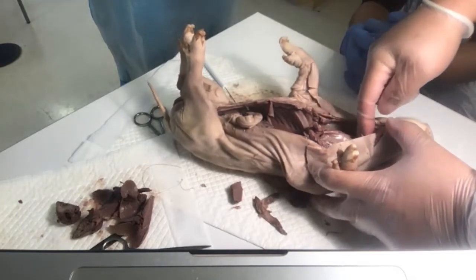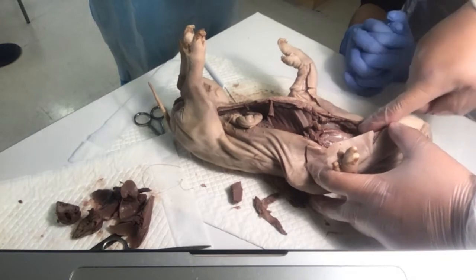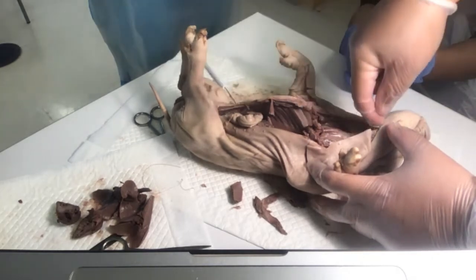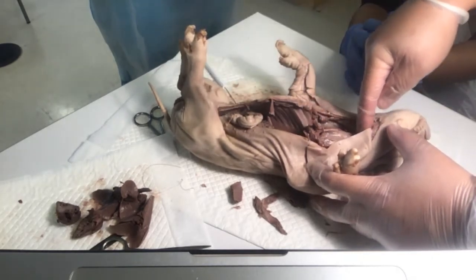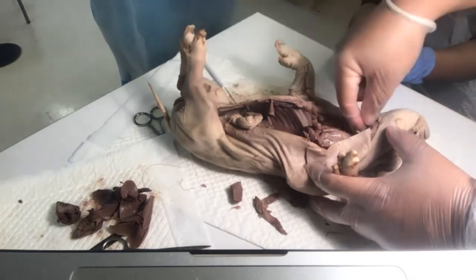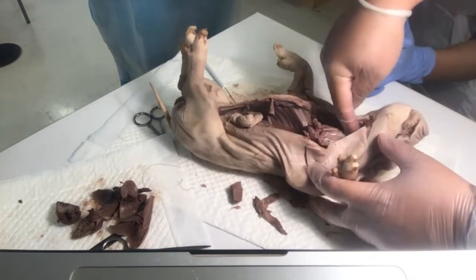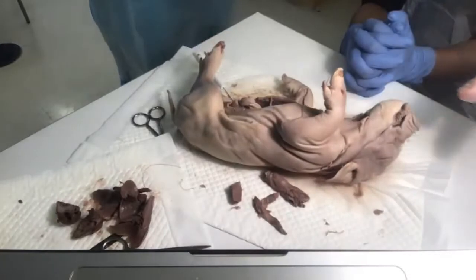So what do I have to do? Remember those cartilaginous rings, right? And the trachea is in the front. So I have to cut in between the cartilaginous rings, then that opens up a hole, right? And that's called a tracheostomy, and then I put a tube in it so that my patient now can breathe. So now there's an airway from here to my lungs and all of this is stuck up.